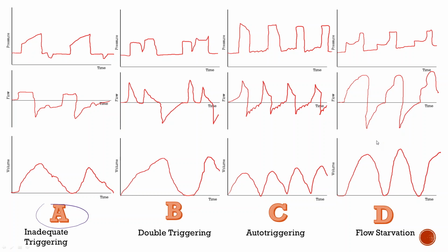Sometimes it just reverberates. How often do those get changed? I actually don't know. PRN. Oh, okay. So if you notice this, you might just need to change the tubing. And sometimes this can cause enough of a trigger to trigger a breath, just like it's doing here.